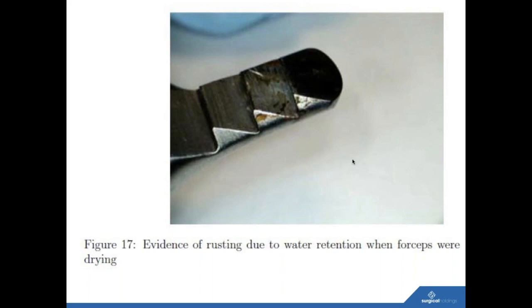Okay, sure. I suppose that also extends now more to the use of post-usage gels and sprays and things like that to ensure that the instruments stay moist. Would that be correct? Yeah, for sure, but also that they're taking care of the instruments, wiping them clean and flushing lumens during the procedure as well. It's really important that they knock as much of the bioburden off the instrument as they can before sending it down to CSSD. Okay, perfect.